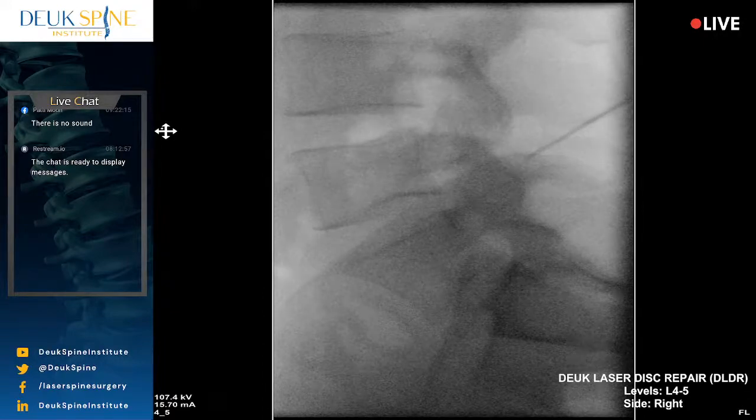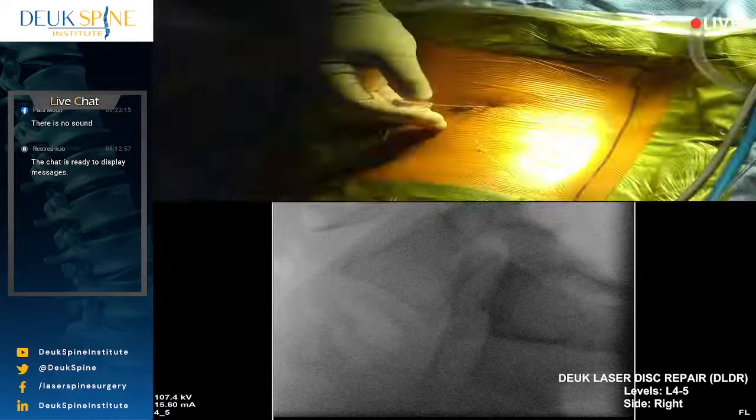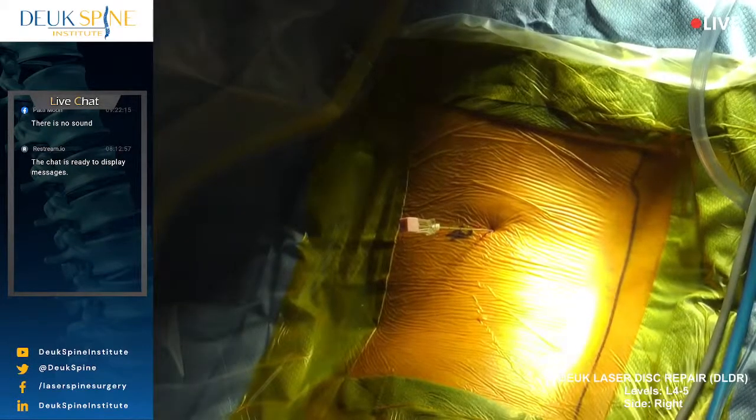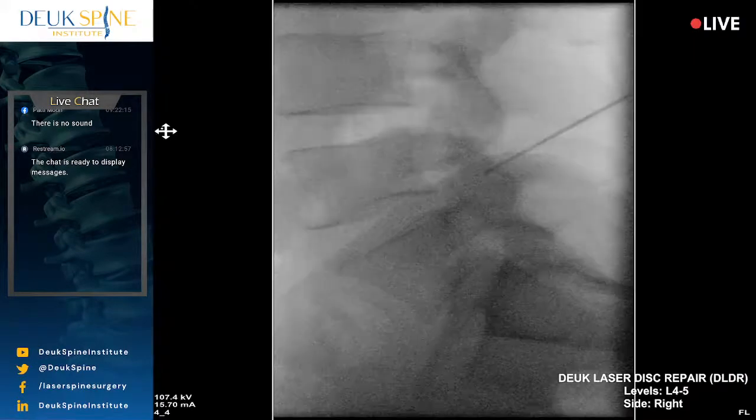You're doing great, honestly. Shot. Let's get an AP. So we're approaching the disc at this point. We're very close.